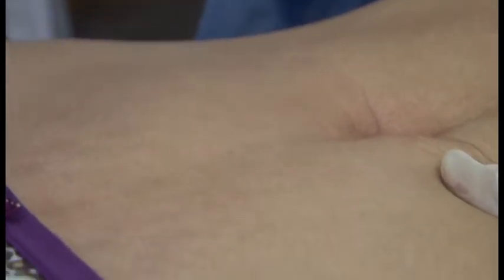And now we go to the other part of the stomach. I stretch the skin, because if I don't stretch the skin, I will bump into the skin and it will be more painful and take longer. So I finish all the passes in this direction, and then I move to the other side. You can do one like this and one like that, but then you have to move your hand many times, and it's quite painful because we work with our hands all day. So I prefer to do a few passes like this and then change and do like this. This way I don't do a lot of movement with my hand.